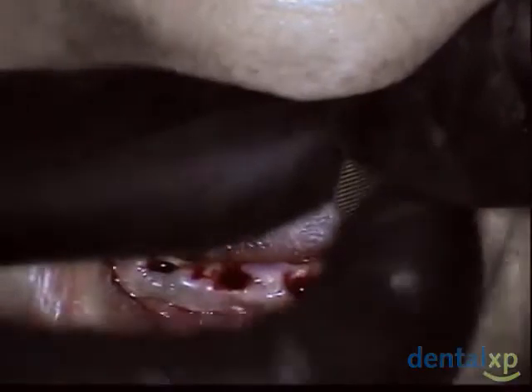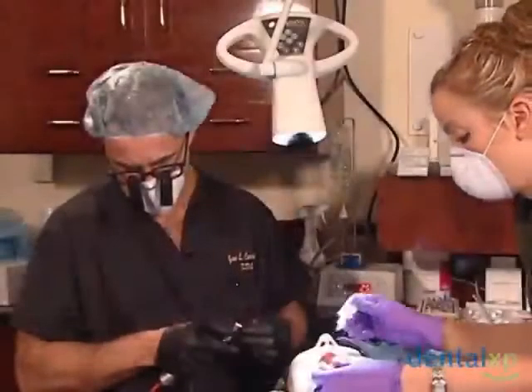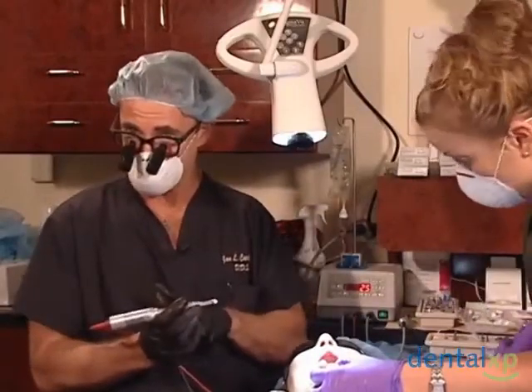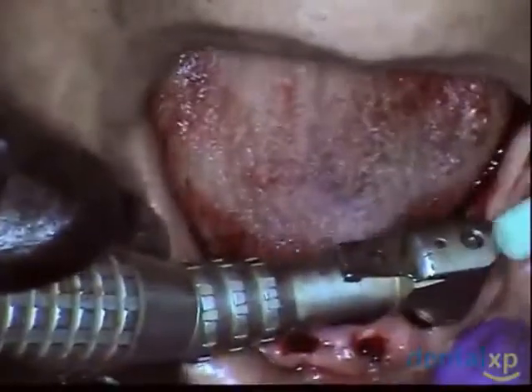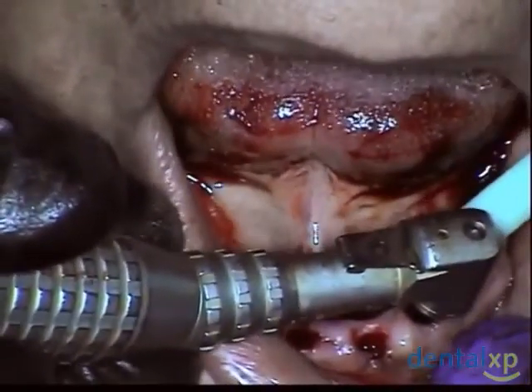Some of you are saying, well, that's awfully snug. What are you trying to do? Again, I'm trying to make sure the abutment seats completely on the bone. So I'm probably going just a little beyond 15 millimeters because that's right where this is tapping. It's right where it's stopping. Are we going to go with a lot of force? We're going to go a millimeter, a half millimeter at most.